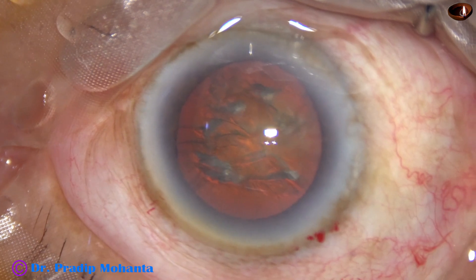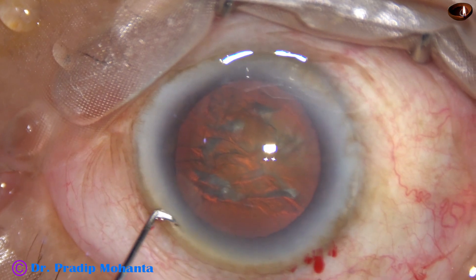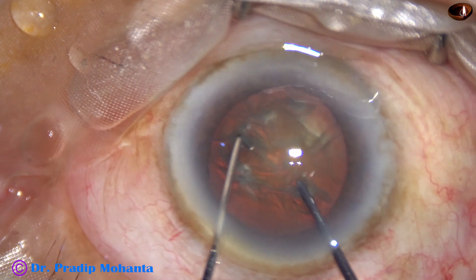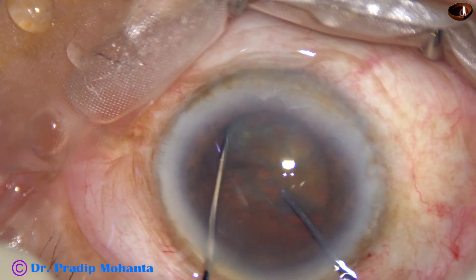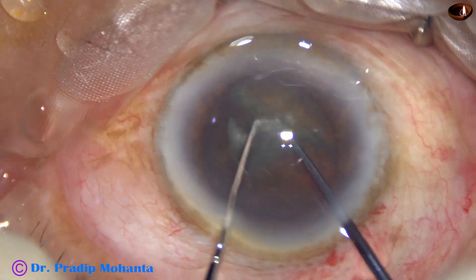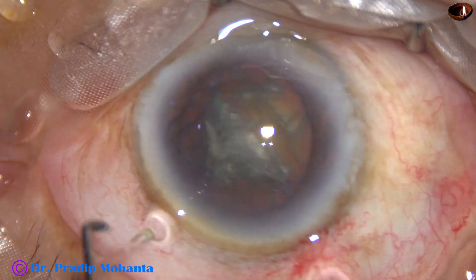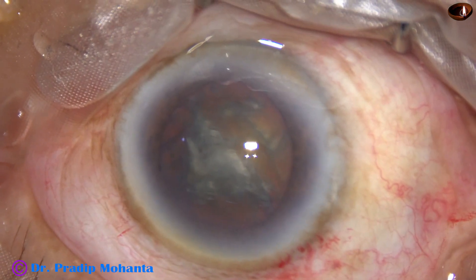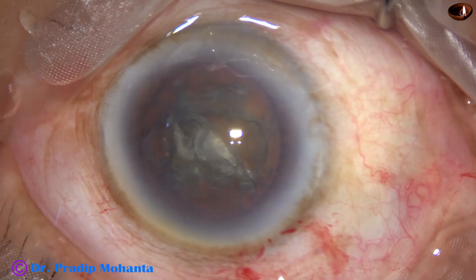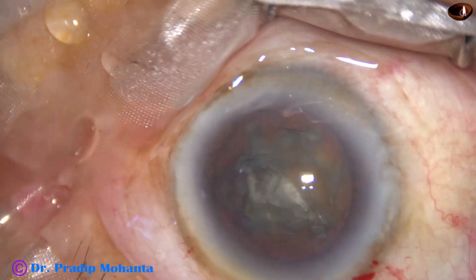And now is the time to introduce the FECO probe. But I tried first to see if I can divide this nucleus with the pre-chopper. But I could not. I should have gone to a deeper plane and tried, but it was superficial. Anyway, we can manage this case.